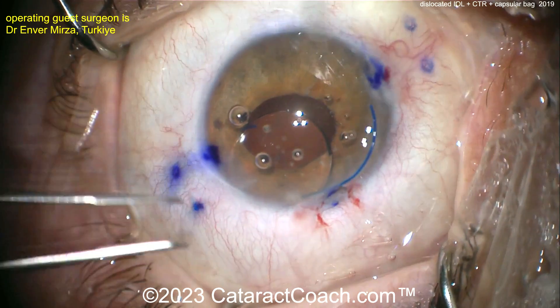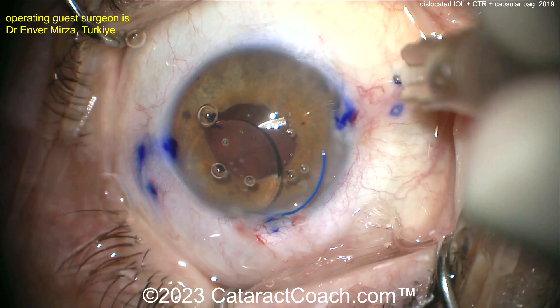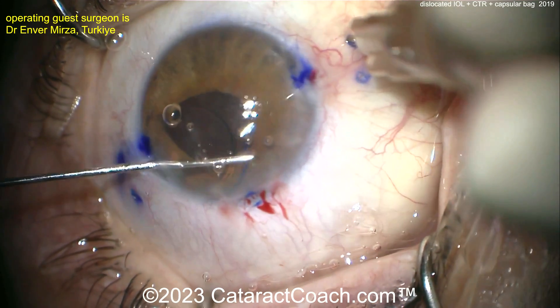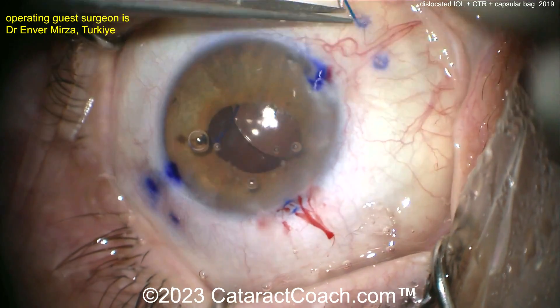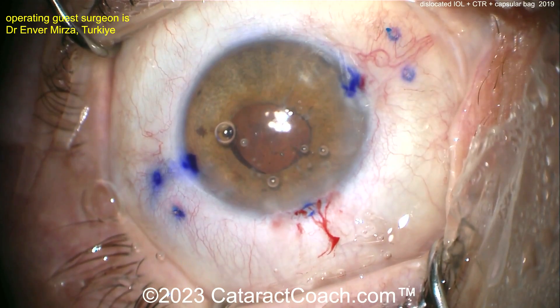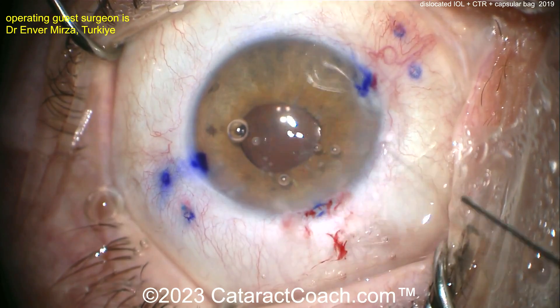More viscoelastic — always a good thing, and we can remove it at the end. Here's the path for the other side — there it goes, entering inside. Doing the lens in the anterior chamber is nice because you don't have a lot of acrobatics going on in the anterior vitreous cavity. That's really nicely done. Now bringing out the other haptic with a little cautery. Important to mark the beginning of the case so the lens is well centered — if your marks aren't 180 degrees apart, it won't be centered.